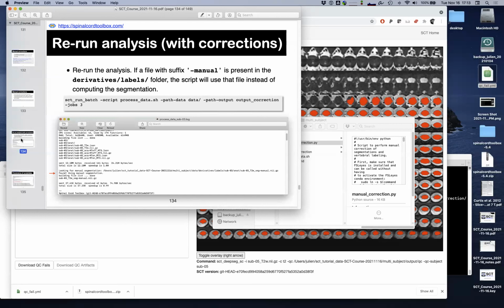So if you have multiple users doing manual corrections, it would be good to be able to append that metadata, so we know when the lab has touched that file. That's a great idea. Great idea. Yeah, it's fairly easy to do, in fact. But yeah, that's great feedback. Yeah, thank you.